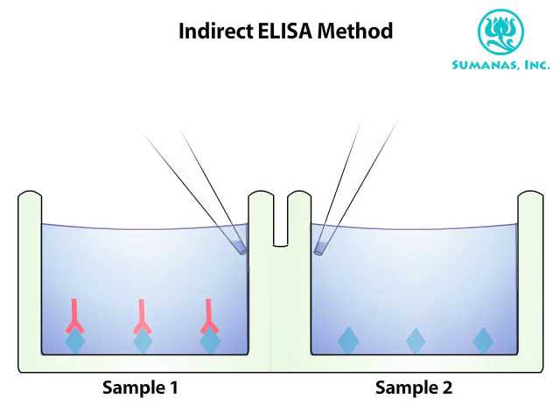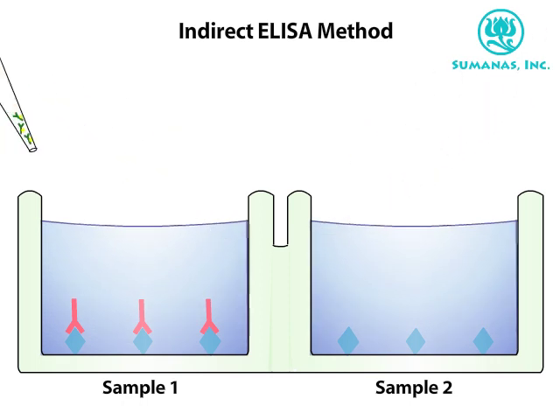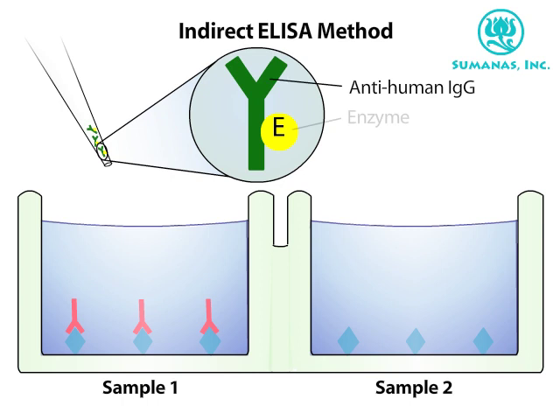If the antibodies do attach to the antigen, they can be detected by the addition of an antibody enzyme conjugate. These reporter antibodies bind to the immunoglobulins, generally IgG, used in the previous step. Since this specimen contains human antibodies, we use enzyme-conjugated anti-human IgG antibodies for the reporter.